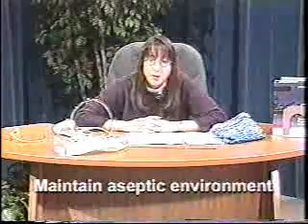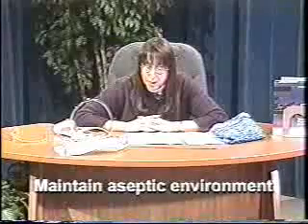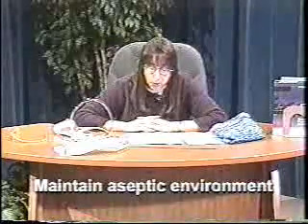Emotionally, the patient may be upset that he or she has lost control of their bladder function. The patient may be fearful that he or she may never regain control of their bladder function. As a caregiver, you must be professional and use a matter-of-fact approach when caring for these patients and be sensitive to their needs.